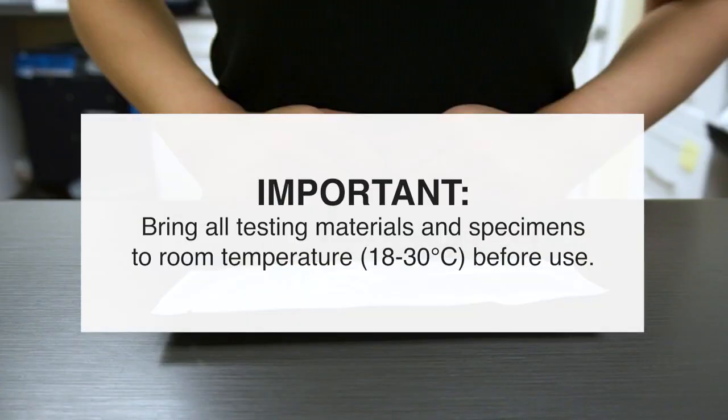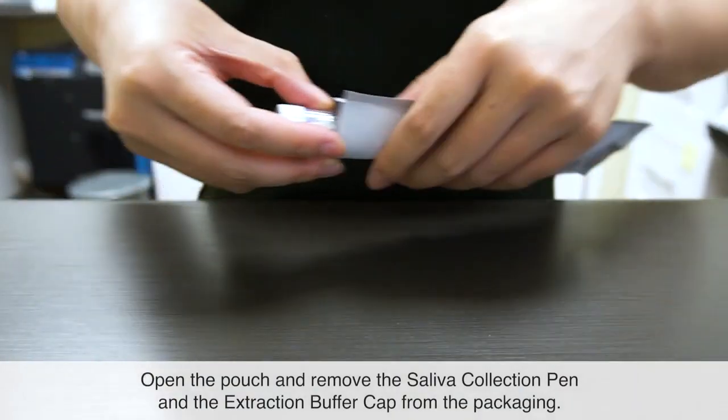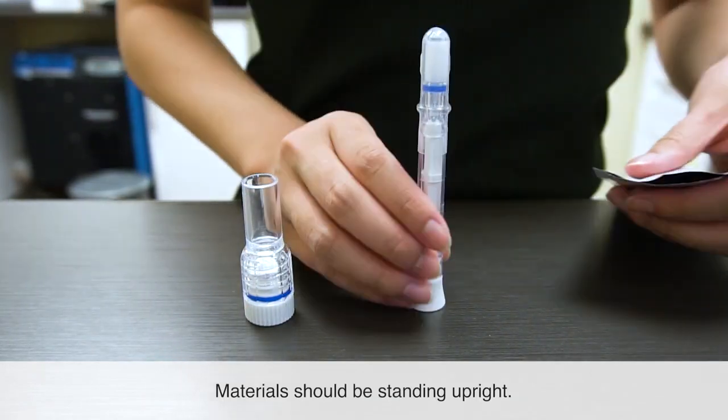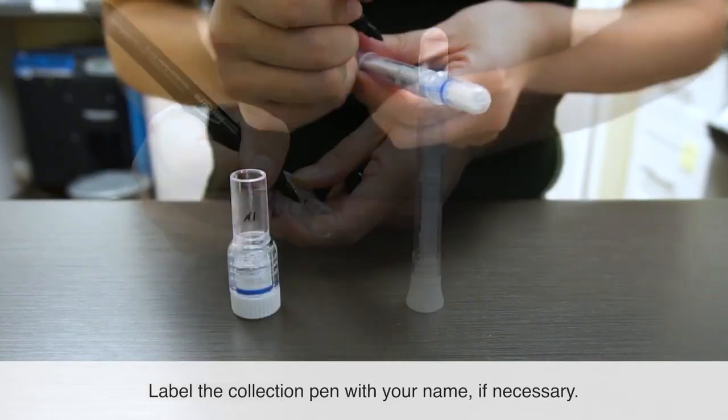Bring all testing materials and specimens to room temperature before use. Open the pouch and remove the saliva collection pen and the extraction buffer cap from the packaging. Materials should be standing upright. Label the collection pen with your name, if necessary.